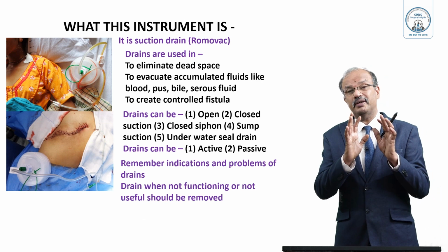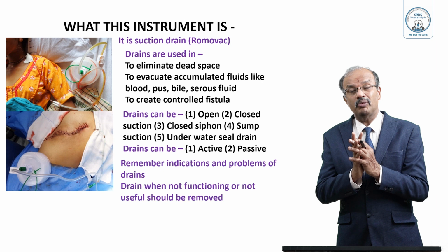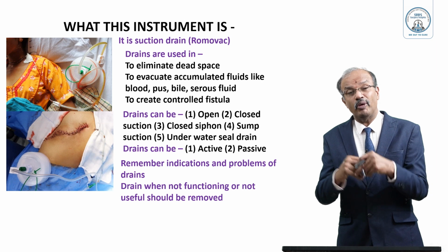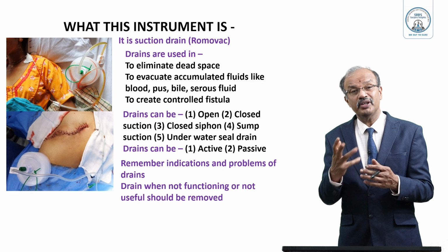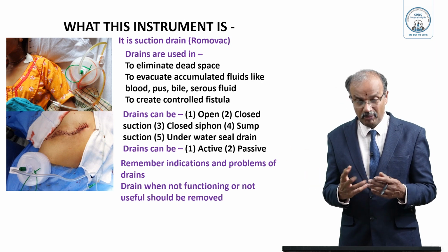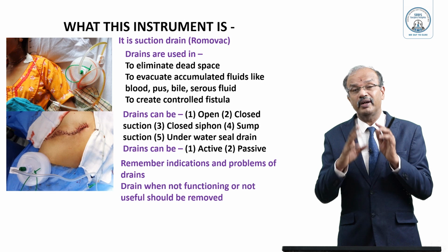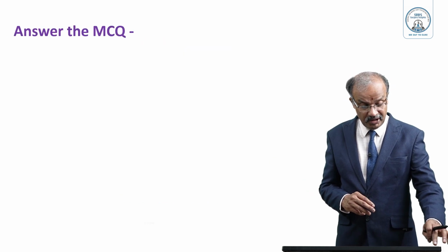So remember, though I'm not going to detail that, the indications and problems of drains. Problems: it may cause erosion, it may cause bleeding, it may not function, it may get blocked, and we may not know whether there is any collection inside. Infection can occur, and erosion can occur if we keep it for a longer time. It may transmit bacteria inside. So there are so many problems with the drain. When the drain is not functioning, or when you think its function is enough, then the drain should be removed. Don't keep it longer than that. That is the concept. So answer the MCQ.